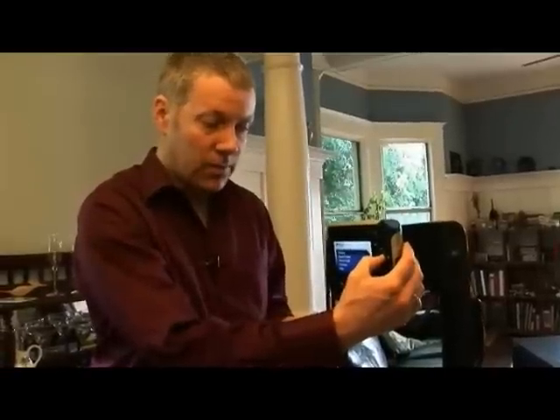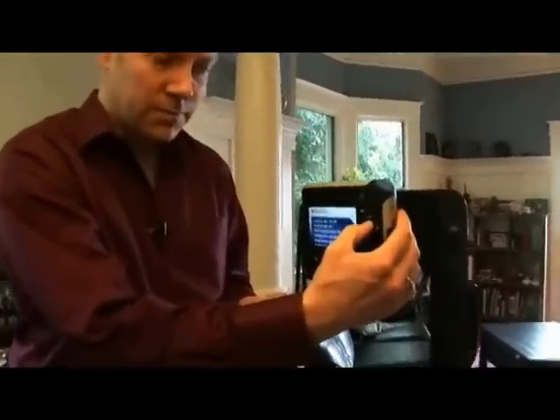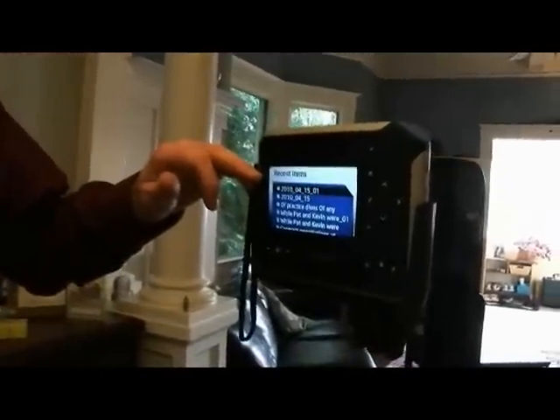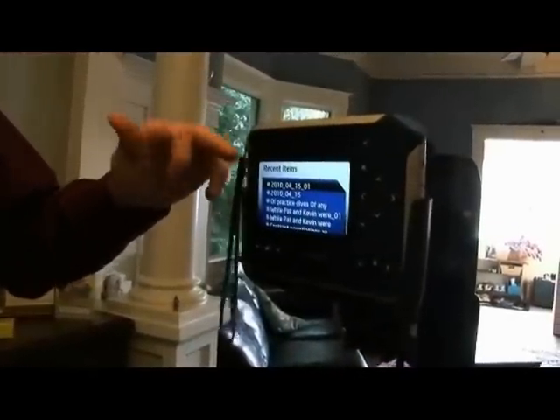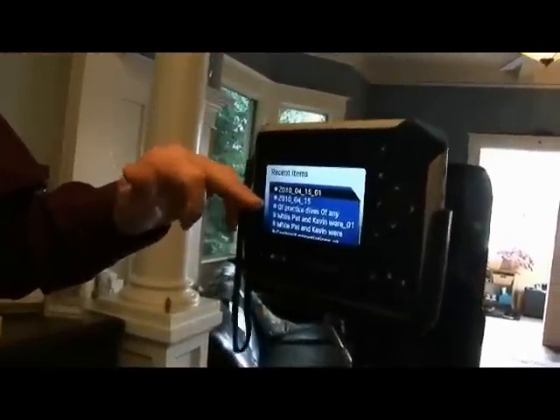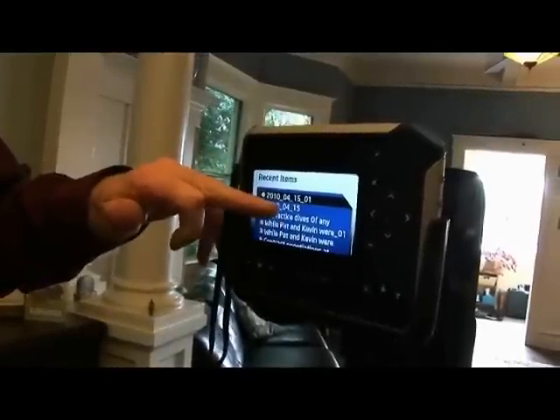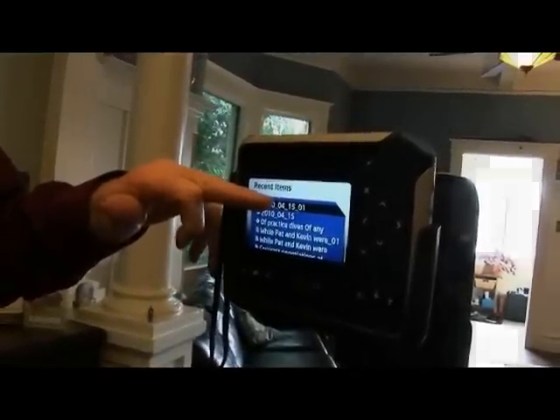You'll see in my library under recent items the captured files listed by date — for example, April 15, 2010. It's still processing in the background, and it will tell me when it has actually completed a page, so you'll get the start of that sentence, and then each page will convert in turn.